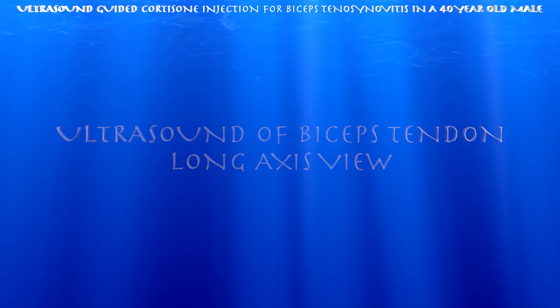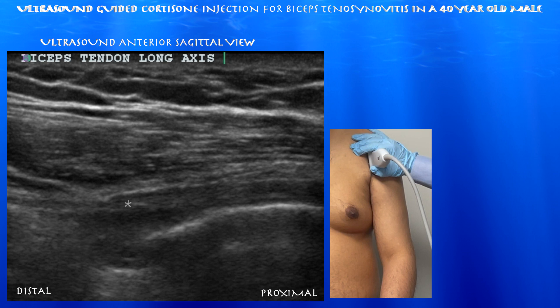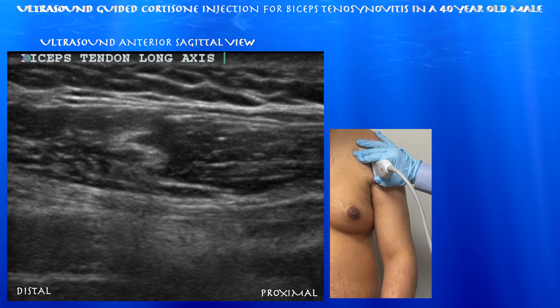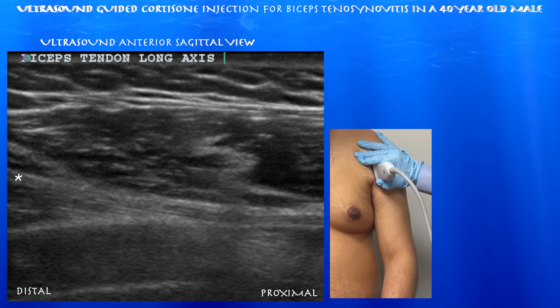Now we're looking at the biceps tendon in a long-axis view. You can see the tendon going basically down the humeral shaft. Again, you can appreciate synovitis and fluid around the biceps tendon. Going distally, you can see how the biceps tendon feeds into the actual muscle — talking about the long head specifically. You can also appreciate the pec major muscle and tendon as well.